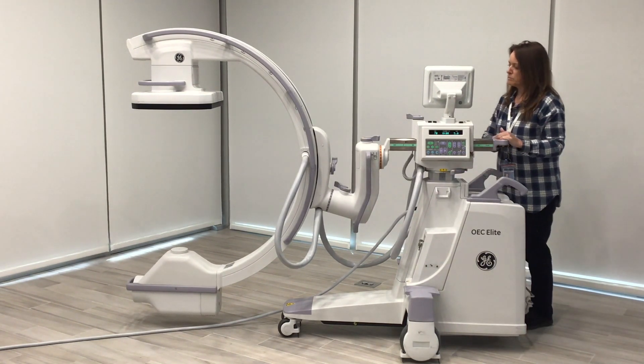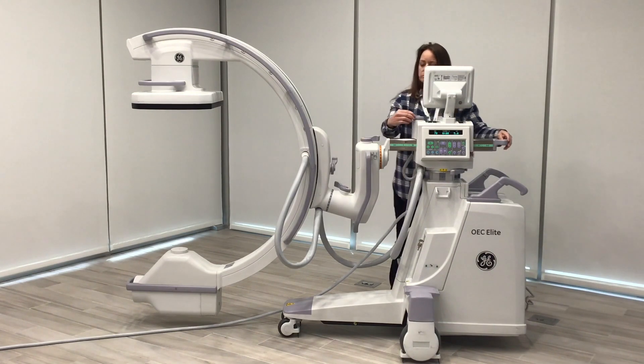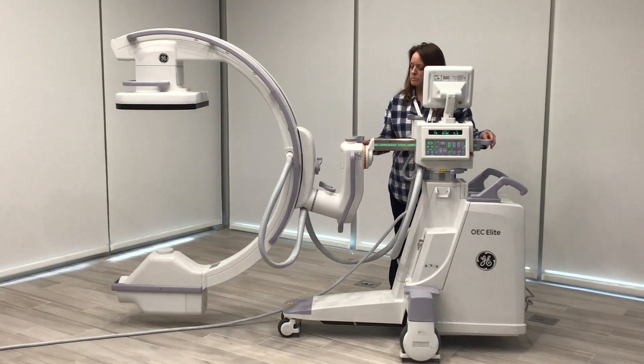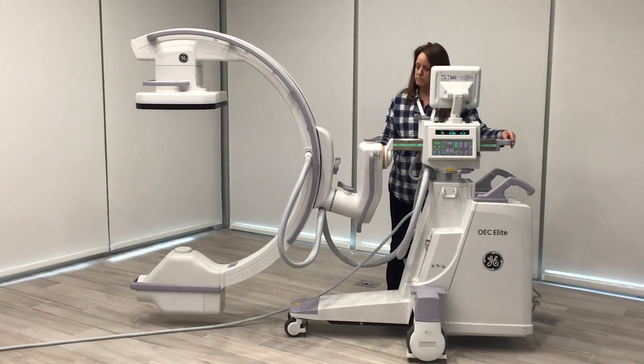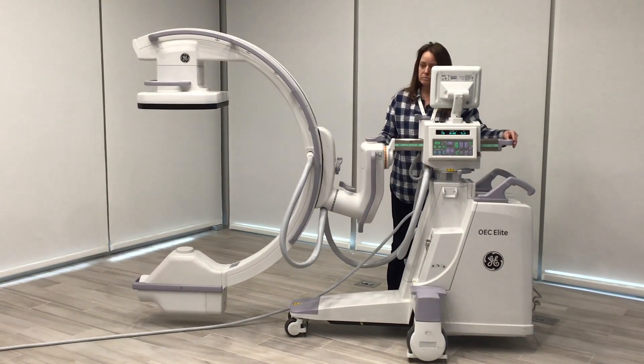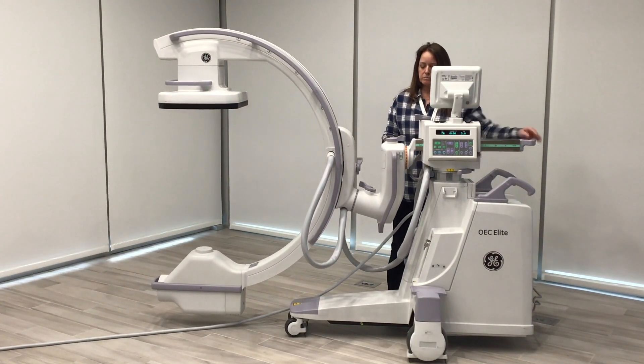After this we move to our in and out lock, which is green on here — they're all color coded. It has 20 centimeters of travel in and 20 centimeters out. It allows you to maneuver the C-Arm straight in and straight out without having to move the whole system.